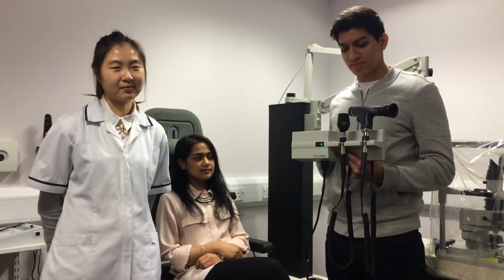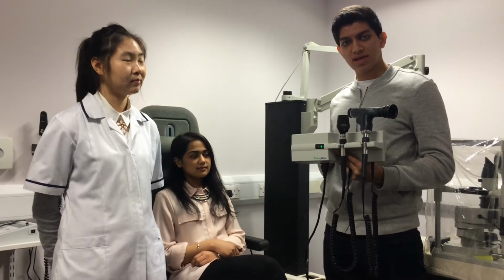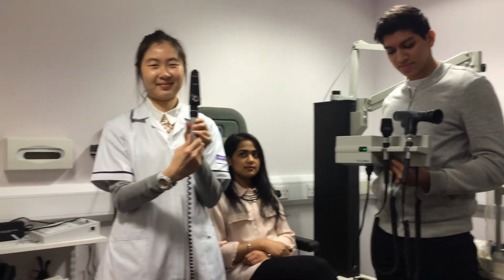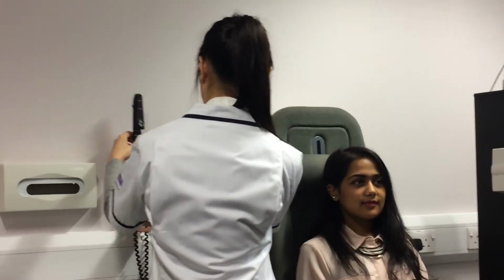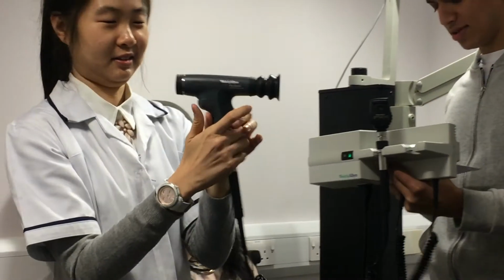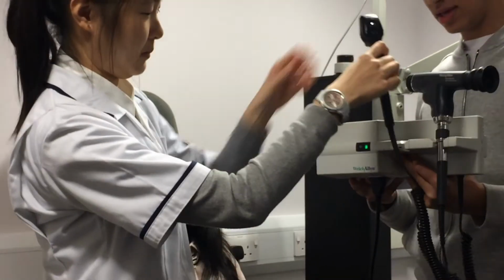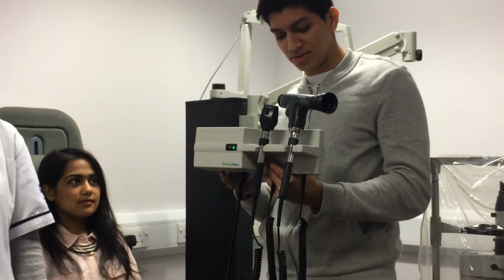Explain direct ophthalmoscopy. There are many different types of ophthalmoscopes available. Keeler has the professional and specialist set. The specialist is the one Valerie will be using today. Valerie also has the Welch Allyn Panoptic ophthalmoscope and the standard Welch Allyn ophthalmoscope at her disposal. The Welch Allyn Panoptic ophthalmoscope is banned from student exams due to it being too easy to use.